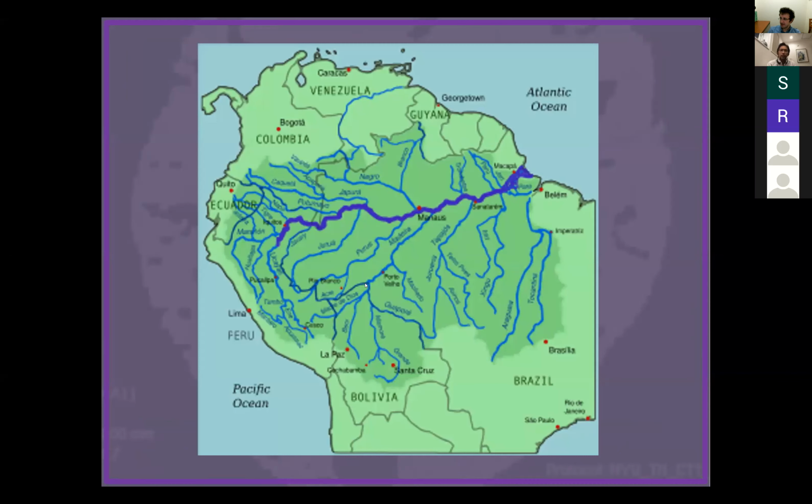So the posterior fossa veins can be a challenging topic. I think the approach to that is in many ways similar to how we approach a lot of other things, the same principles apply. One of the principles is that veins are like rivers. The vein is as big as the sum total of all the streams that have joined it. That's always something important to keep in mind.